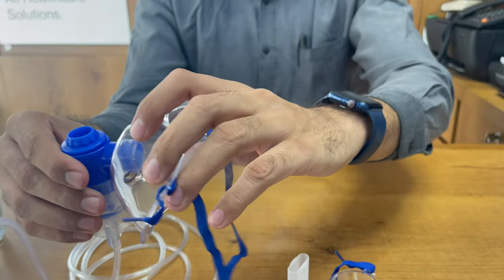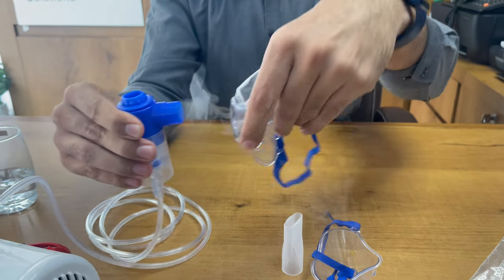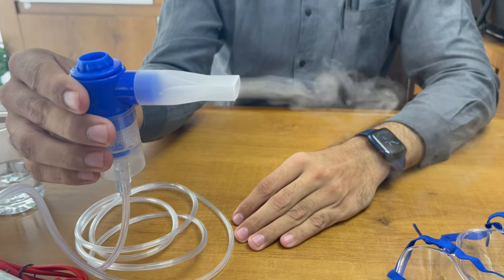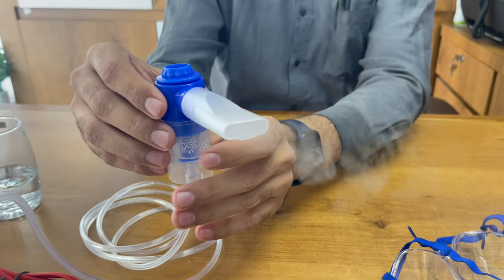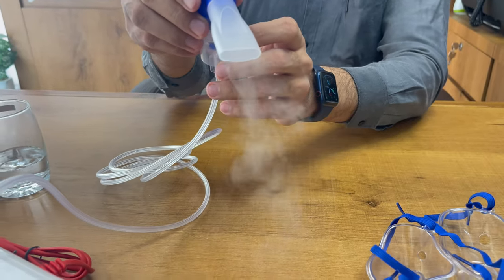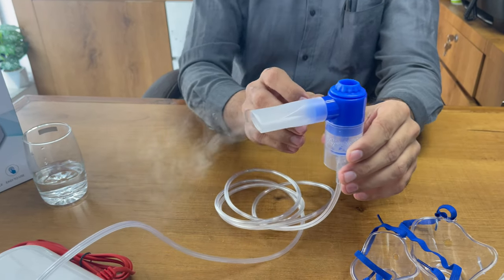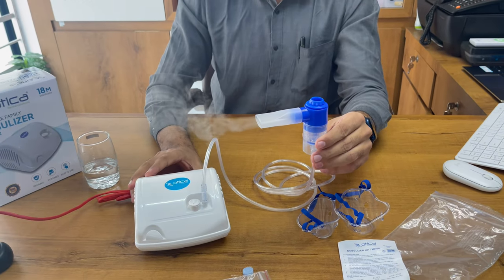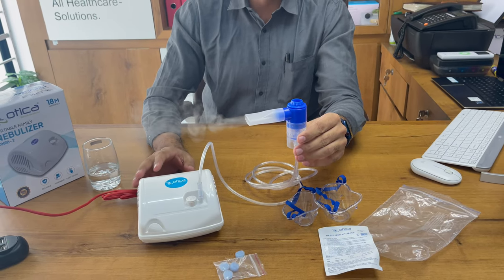You can also connect the mouthpiece if you want to take the fume directly. This is how it looks. You can see I am rotating it — you can understand the fume coming from the machine.